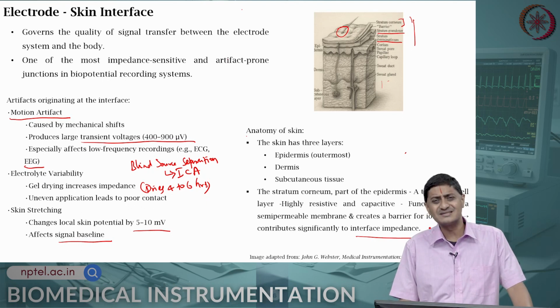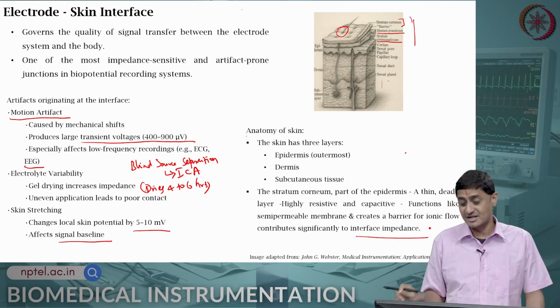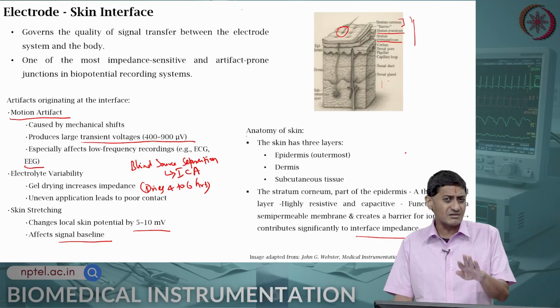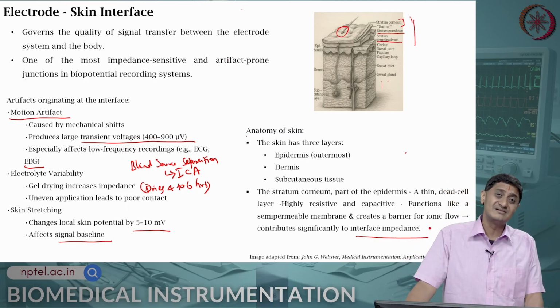Just imagine this process. If you shave, already it is an irritating situation, and then you abrade with sand paper and then you apply alcohol on top of it. It is somewhat uncomfortable. But if you want high quality recordings, many times this is needed.